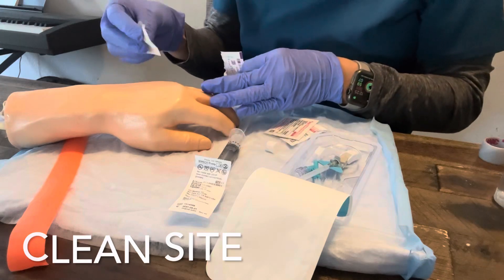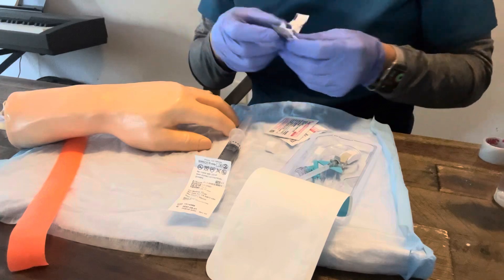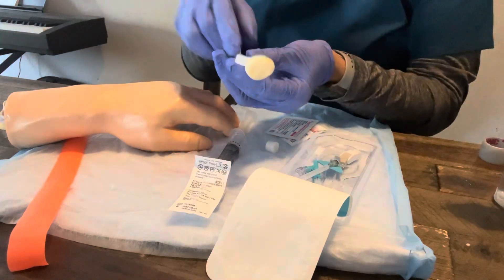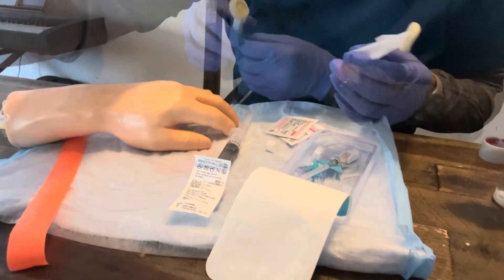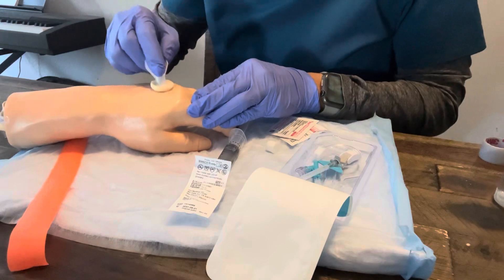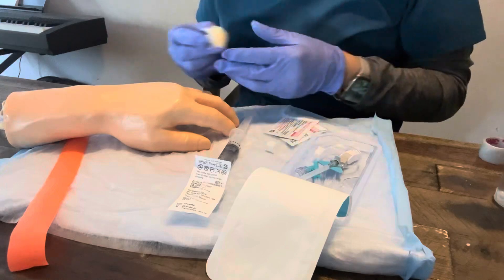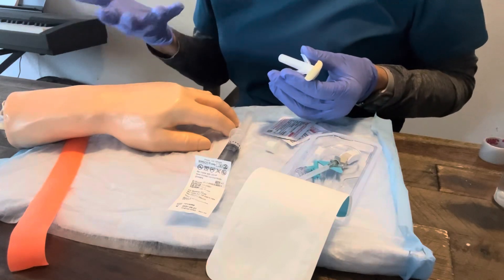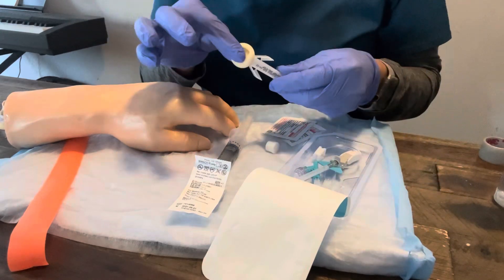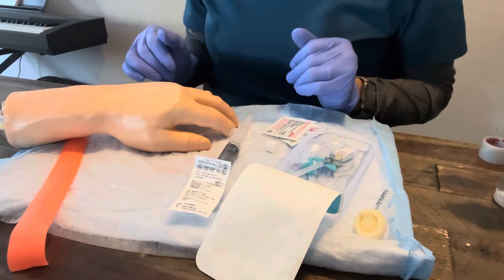There are different ways of cleaning — you could do a hashtag motion or a circular motion. You just want to clean it for 30 seconds. The little kit might come with a chlorhexidine swab: you push it, it'll pop, engage it, and do a hashtag motion back and forth, up and down. That also helps the vein kind of pop up a little bit. Sometimes I'll also clean the tip of my finger in case I want to palpate, since I'm touching a clean site.